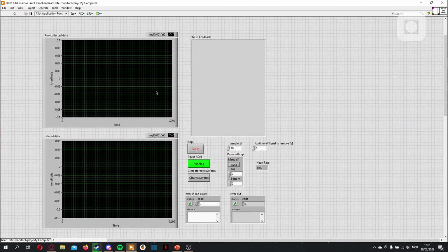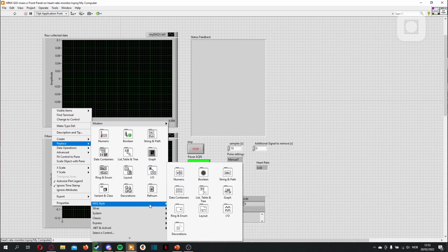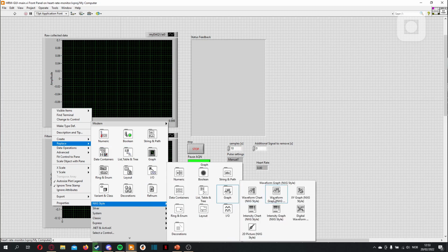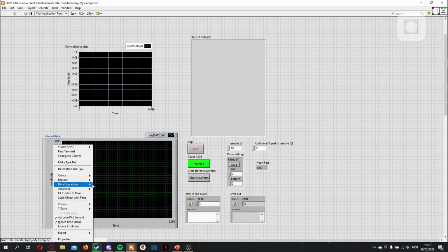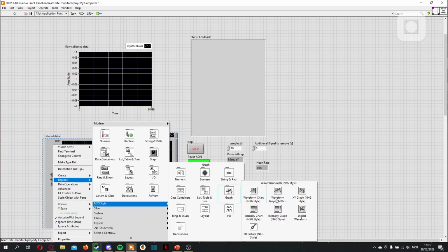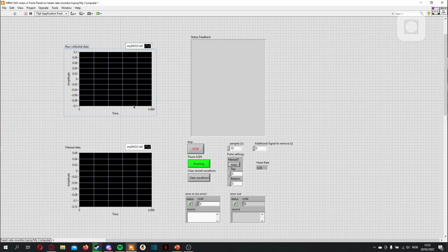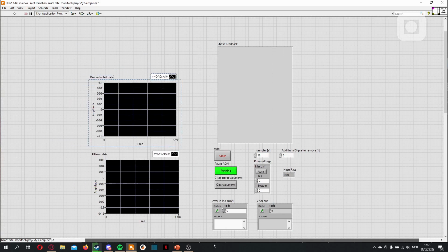The first thing we can do is to utilize the space a bit more. We can start off by replacing these graphs. You could delete them and add a new one, but the quickest way is to replace them, because then you mostly keep all the settings. So I like the NXT styles, and we want the graph. And we can do the same with this one. Now, I don't need to see these two at the same time, so I'm going to make a tab, which I'll put them in.